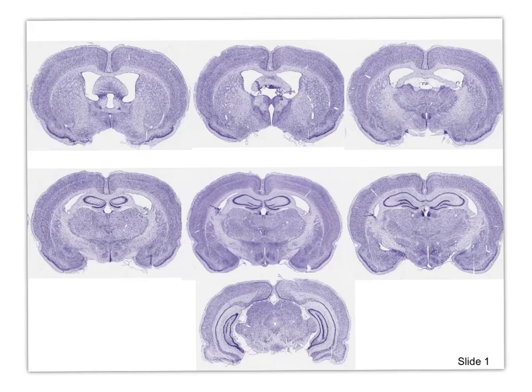Just want to do a quick tour of the rat basal ganglia because it occurred to me that there's some major differences that you should know about. So starting with the top left section here, just quickly orient you. This is the fornix here. This is the anterior commissure right there. This is Nissl stain. So all the blue things that you see are cell bodies. And then the whiter areas are fiber tracts.